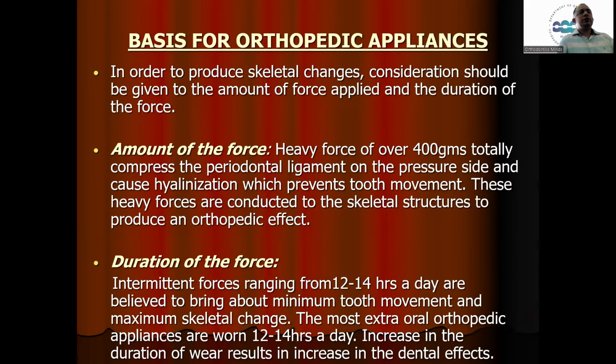The duration of the force. It is the intermittent forces ranging from 12 to 14 hours a day that are believed to bring about minimum tooth movement and maximum skeletal change. Most extraoral orthopedic appliances are worn around 12 to 14 hours a day. And an increase in the duration of the wear results in an increase in the dental effects rather than the orthopedic effects.